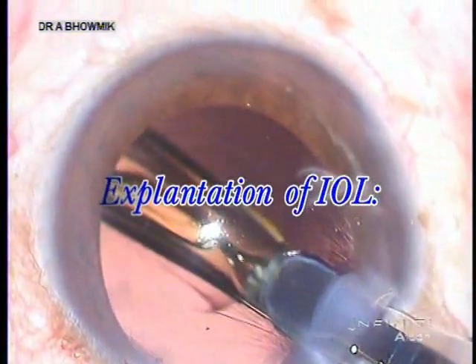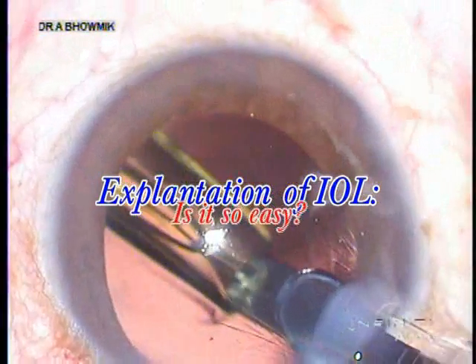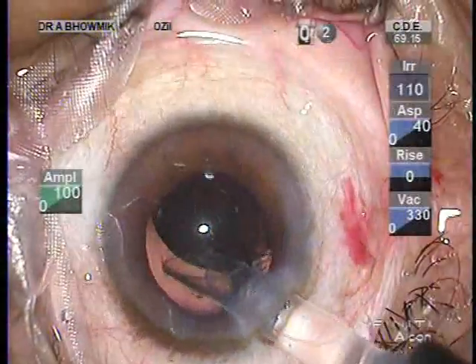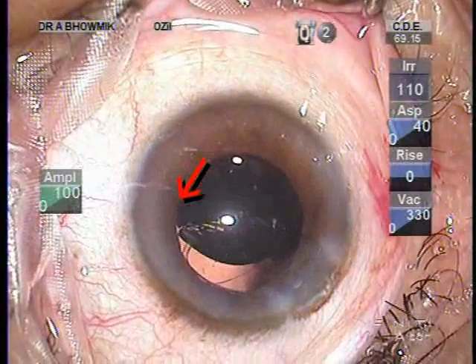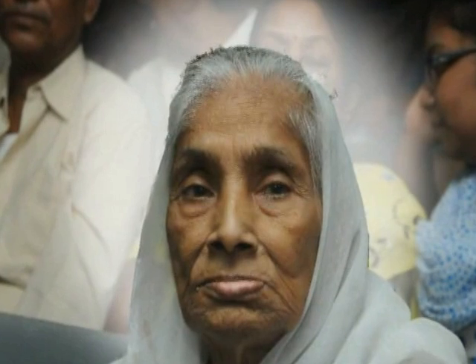IOL explantation — is it easy? My video editor showed that it's simple: just play the video in reverse. Explantation of foldable IOLs is not uncommon. This situation can develop due to damaged IOLs, biometric surprises, or newer IOL models with their halos, which makes a usual story quite extraordinary.